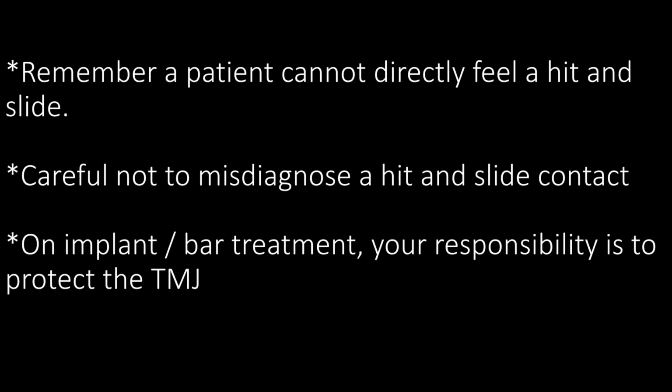Remember, a patient can't directly feel the hit and slide. They only feel the denture base wobble, or the thing's breaking, or it's uncomfortable, or it's rubbing on the gum. We typically misdiagnose that hit and slide because the patient can't tell it's happening. It's very difficult to see visually. And again, remember, we're here to protect the temporomandibular joint, especially on implant cases. And so remember, they can't feel their teeth touch.